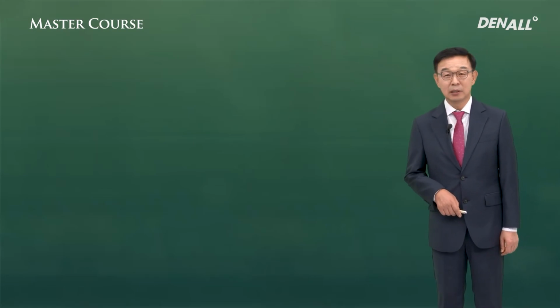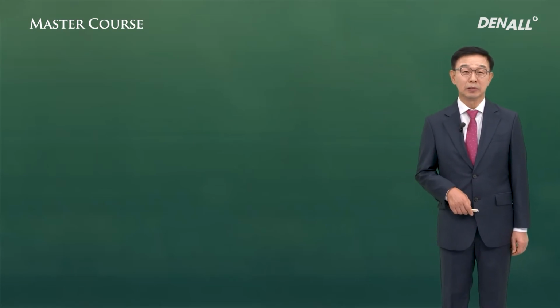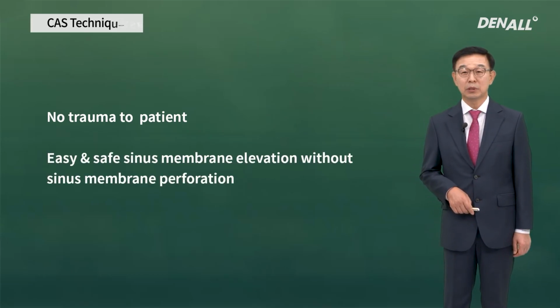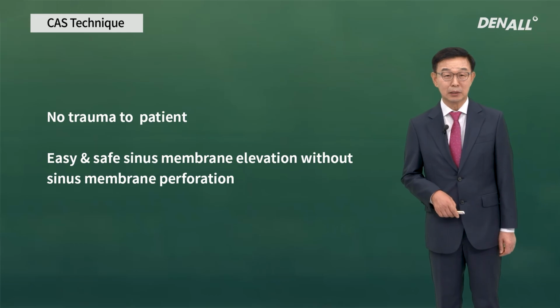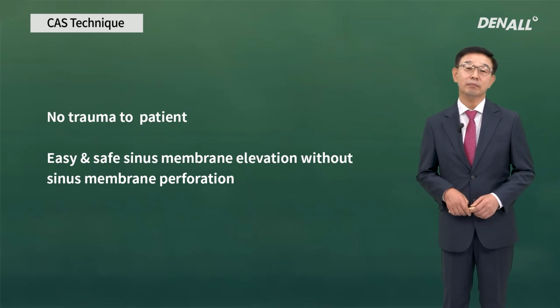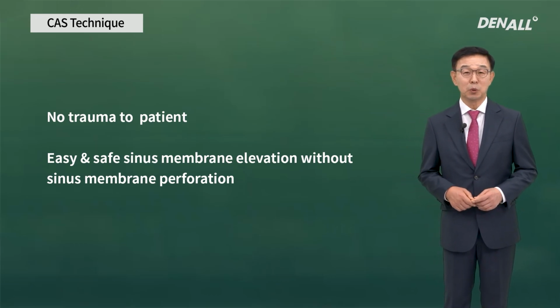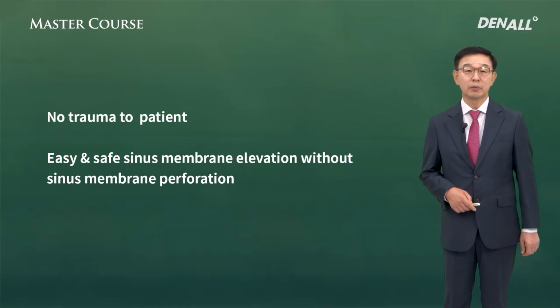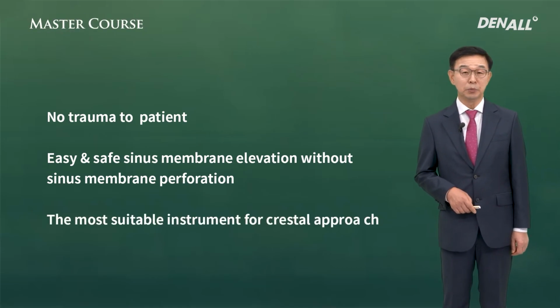The best way to do crestal approach is to minimize patient trauma and maximize surgeon's satisfaction. In that respect, if you use CAS kit for crestal approach, you'll be able to do it without sinus membrane perforation in a fairly easy and safe way, and this is an optimized tool for that.